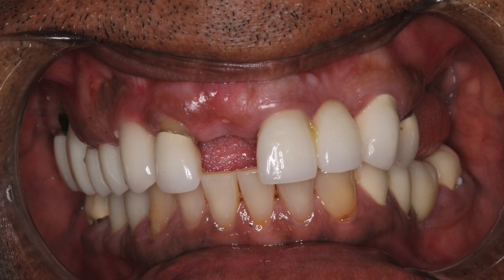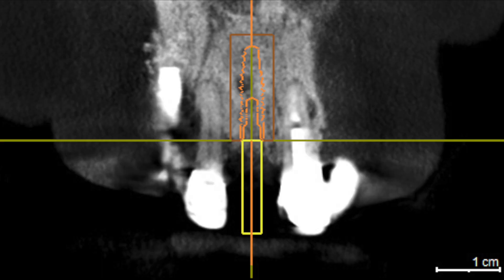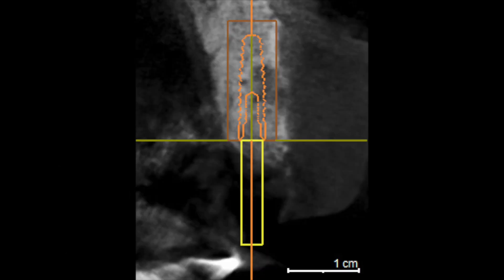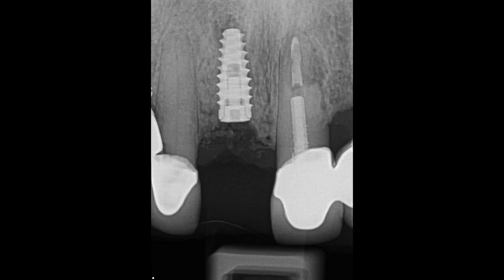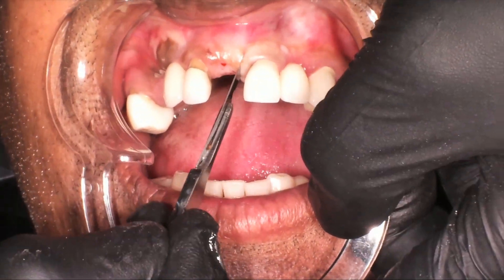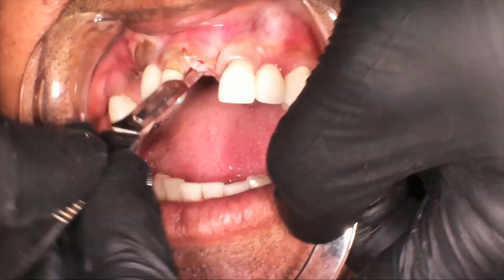This week we have a patient missing tooth number eight. Here he was at consultation time with the tooth missing. Here is our virtual plan. You'll notice on the cross section that there is a potential bone defect that we were prepared to handle at the time of surgery — it turned out to just be less dense bone. Now we've placed the implant, and here we are roughly four months later and he's ready to get a provisional. With all my anterior cases, I put a provisional in place, and we took the impression at the time of surgery.